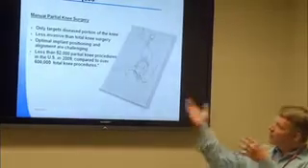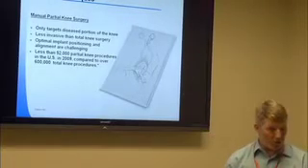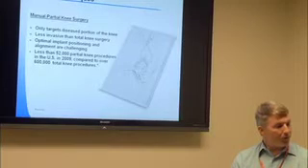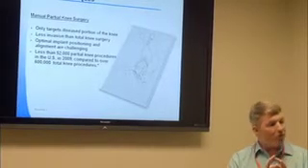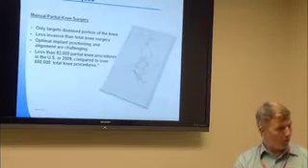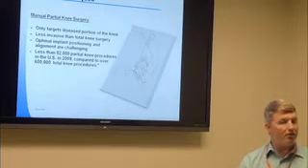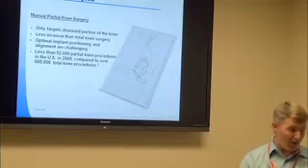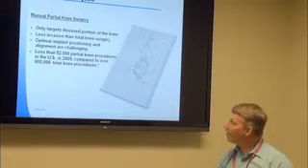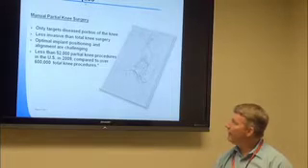So now when we get back to talking about the partial knee surgery, when you have isolated arthritis, the partial knee replacement is a good option because it goes to the source of the problem. You can preserve the healthy cartilage and the healthy ligaments and structures in the knee that you would otherwise sacrifice in a total knee replacement. So with partial knee replacement, it only targets the diseased portion of the knee. It's less invasive than total knee surgery.